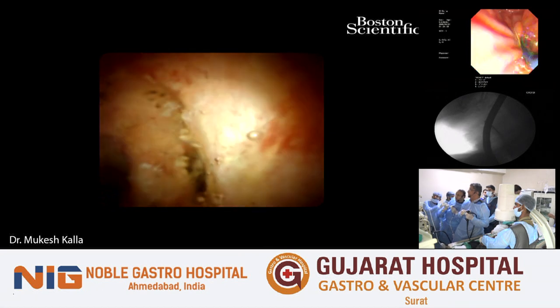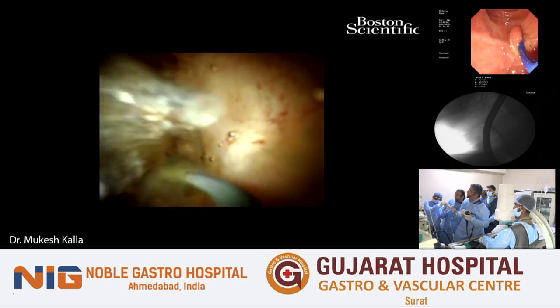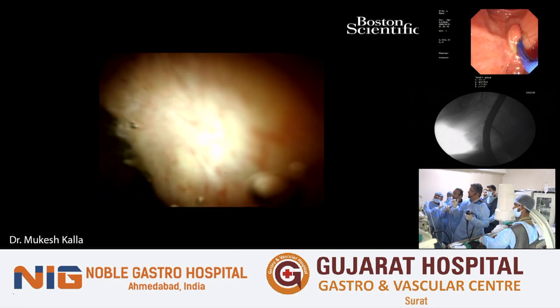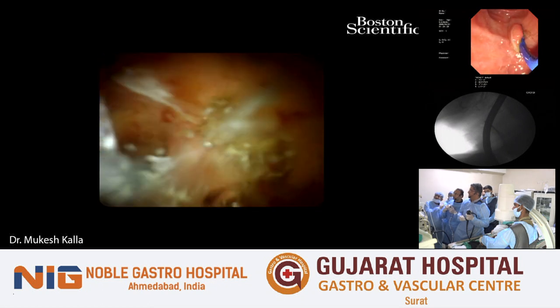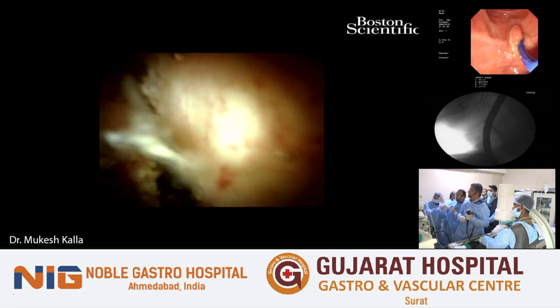And what if there is so much fibrosis near the mouth of the cystic duct? See, as I said right in the beginning of our case presentation, it is all about hepatobiliary anatomy. If hepatobiliary anatomy is favorable, then there is nothing which cholangioscope can't do along with the help of laser lithotripsy or EHL.